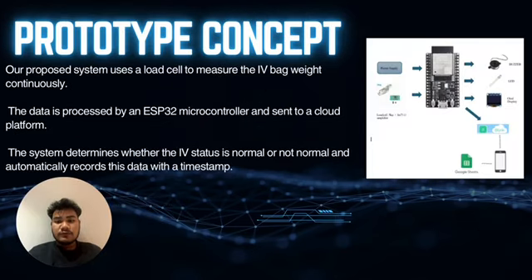For the prototype concept, our proposed system uses a load cell to measure the IV bag weight continuously. The data is processed by the ESP32 microcontroller and sent to the cloud platform, that is Google Sheet. The system determines whether the IV status is normal or not normal and automatically sends the data with a timestamp.